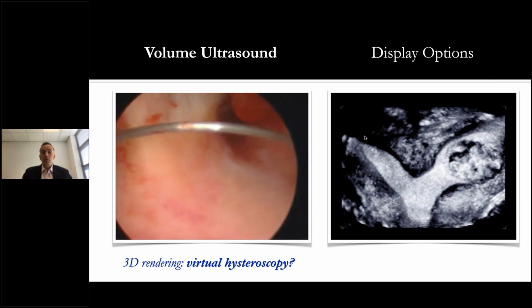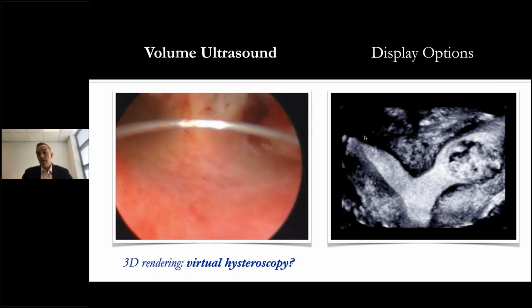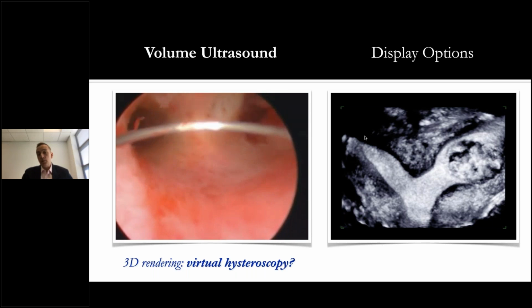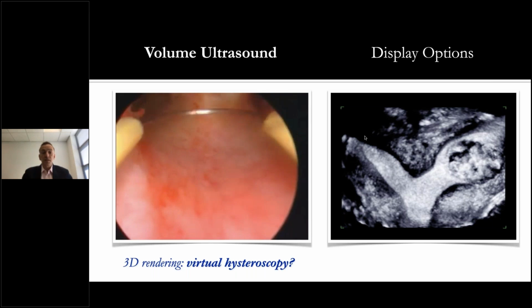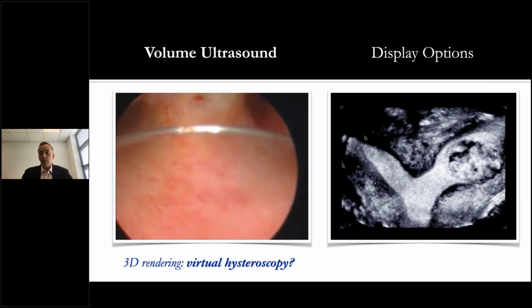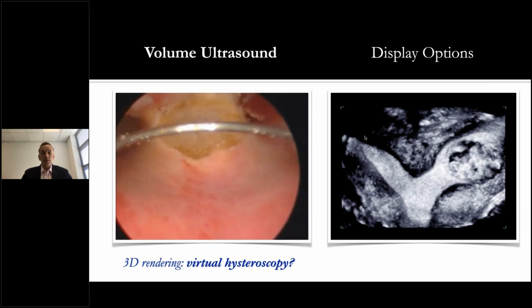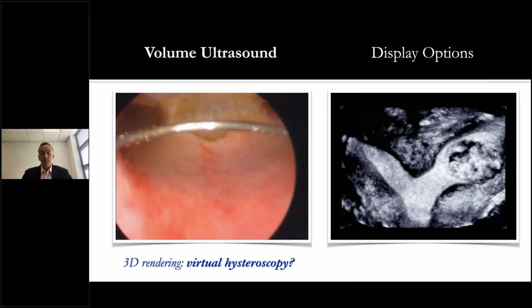You know again what to expect. So in this situation, we do actually resect the septum and most of the fibroid. We now just use cold scissors for the resection. So this is an old video, but again, I think it shows the beautiful images you can get from 3D that really are very difficult to obtain with 2D or to explain to somebody else, your reader.